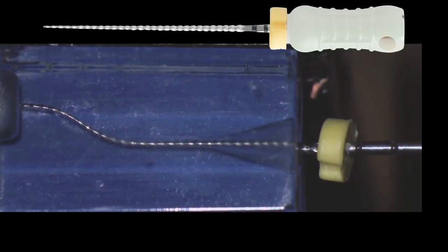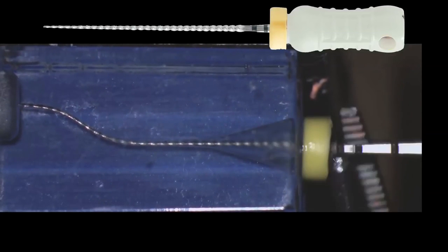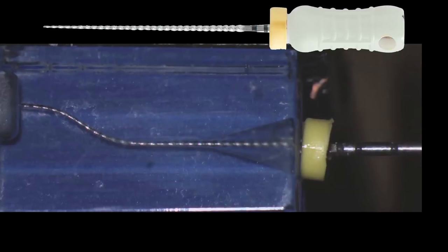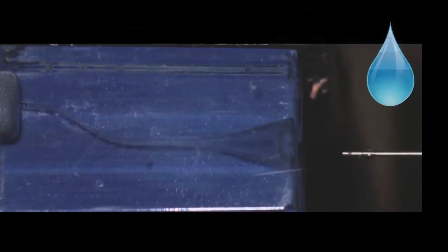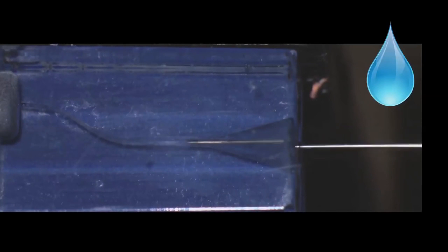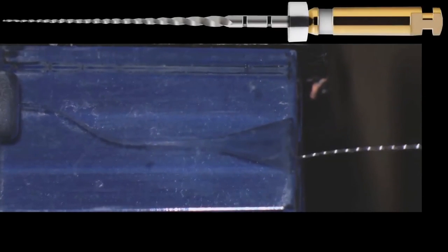We will adjust the rubber stop. We take the file, and now we have acquired that vertical dimension, the working length. We measure that, we record that, we will irrigate. Remember that every file that comes out of the canal requires irrigation. And now we are going to proceed to create that glide path.